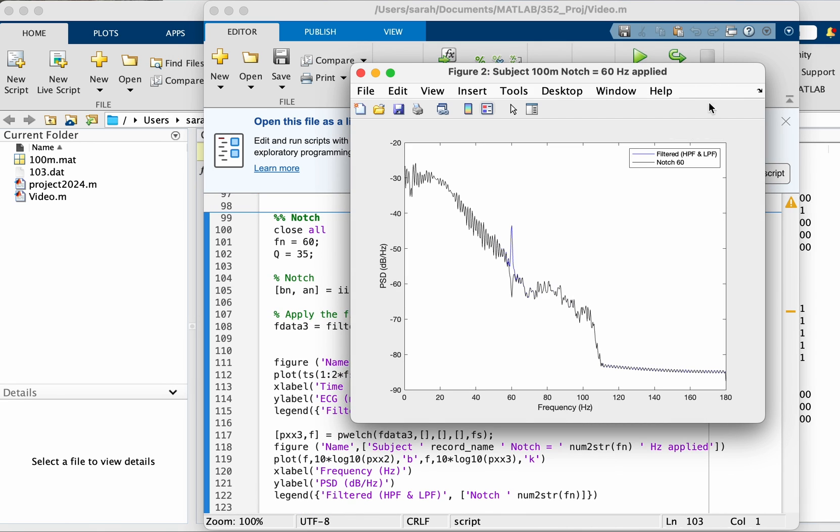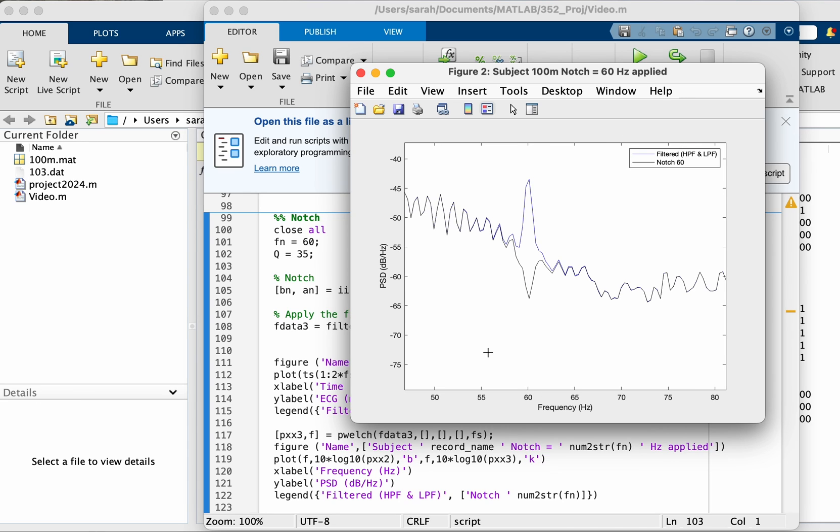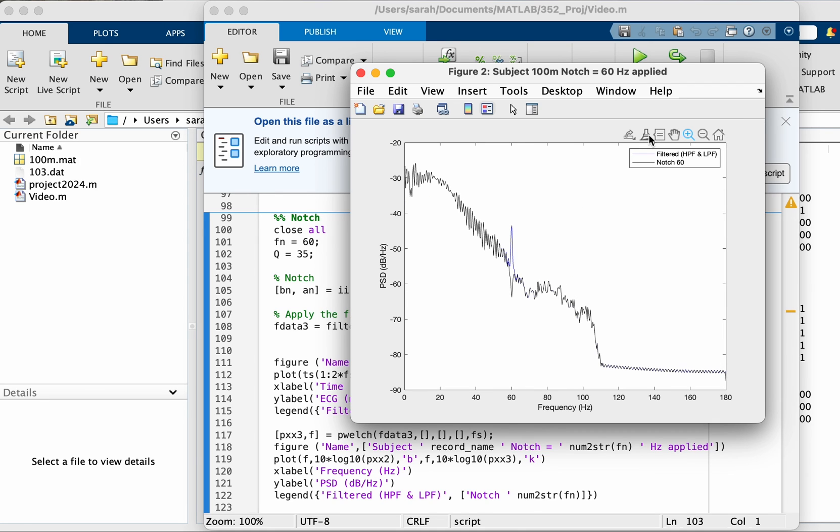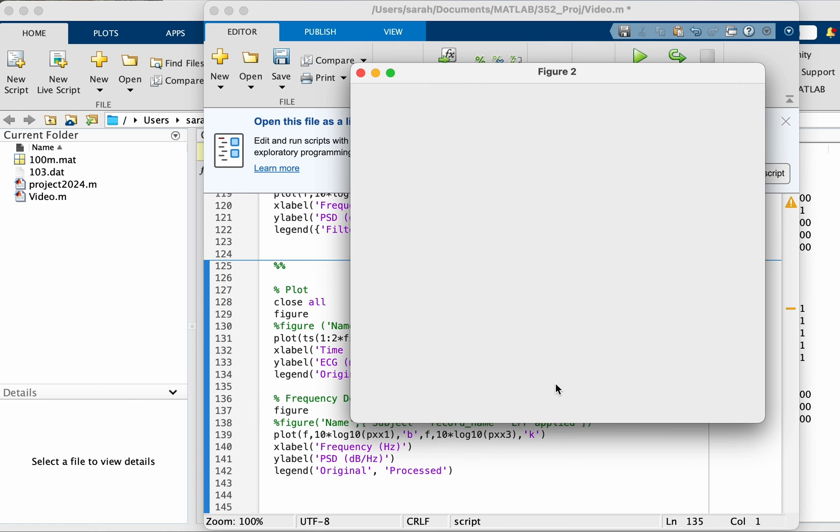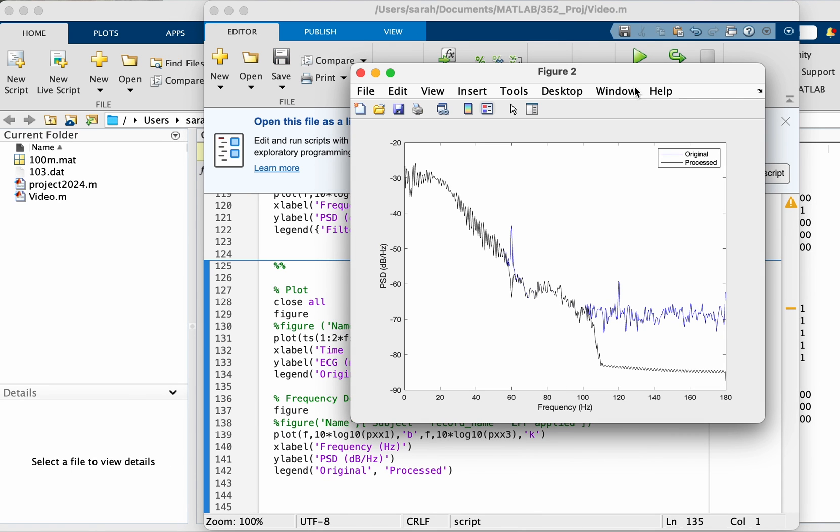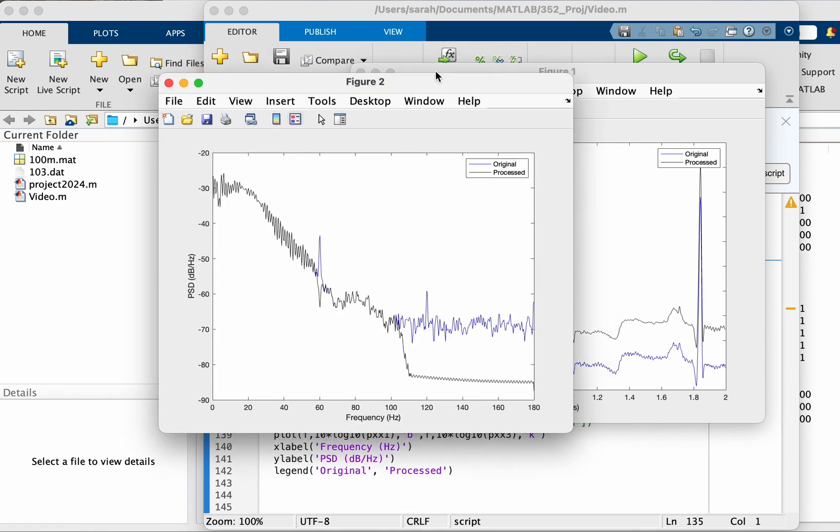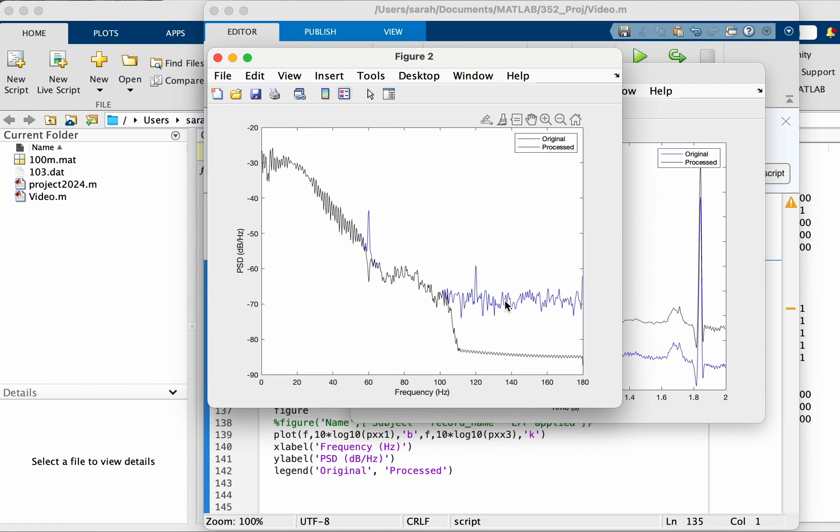Okay, as you can see, the peak at 60 was removed and was replaced with a dip, so it was heavily reduced. Let's now compare the original versus the processed signal.